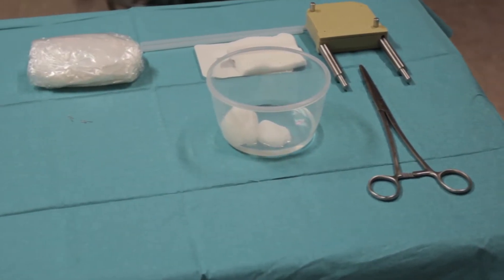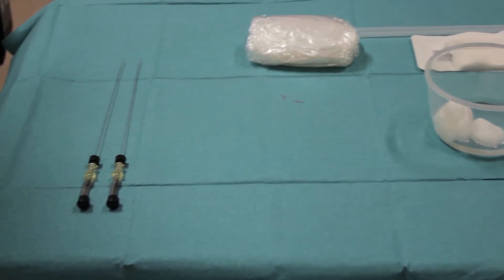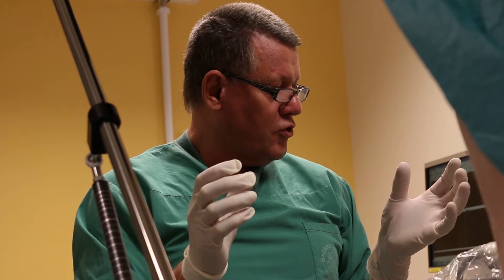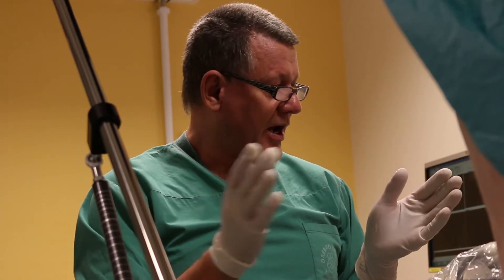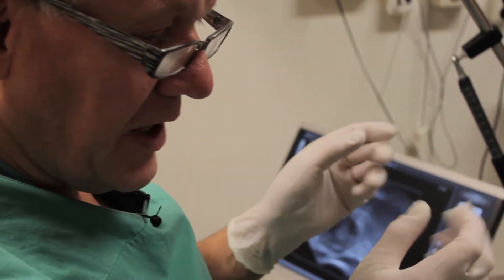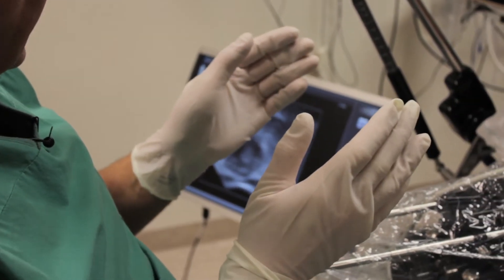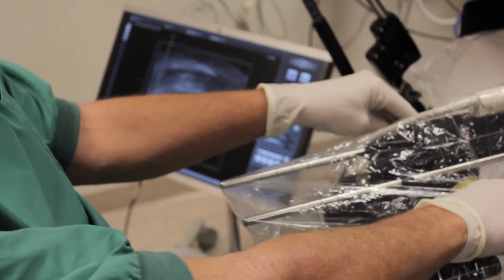We are now going to do an implant of the gold marker. I will try to put in one linear marker at the right prostate lobe and one point marker at the left side of the prostate gland.